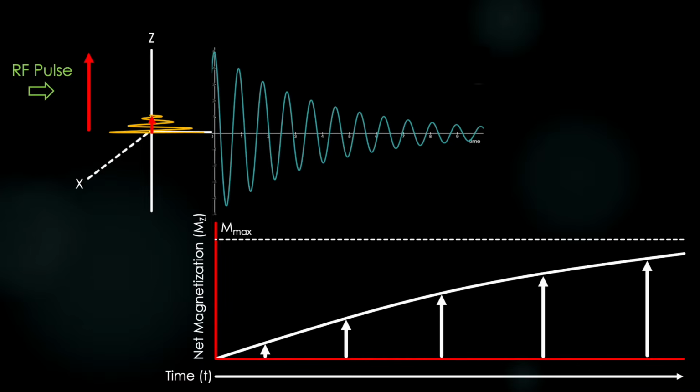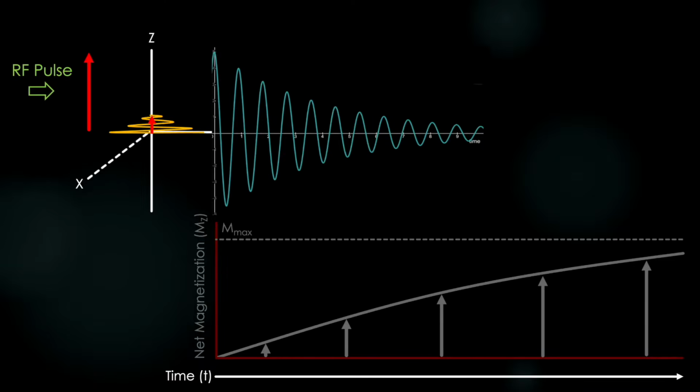We do not fully rebuild our net magnetization by the time this T2 decay fizzles out. Not even close. It's even more exaggerated than this in real life. And critically, we cannot see this T1 process. This is happening in the background, another huge conceptual leap that current teachings fail to flush out. Remember, the only thing our MRI machine can see is T2 decay.